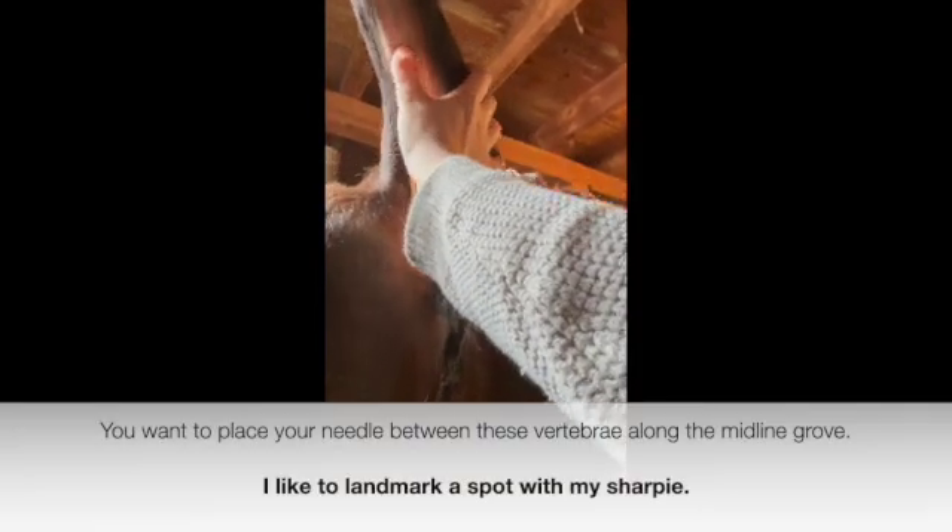Got my cloth here. First thing I'm going to do is a little clean. I'm just going to lift up on her tail — the closer you are to the base, the easier it's going to be to clean. This right here is called the midline groove, and this is where the vein lies. There are little vertebrae you can feel, and you can feel where the vertebrae aren't.